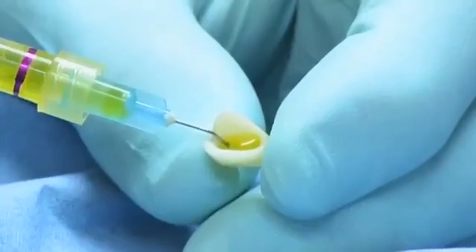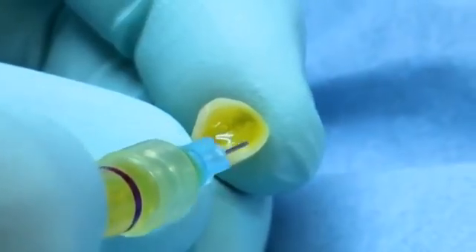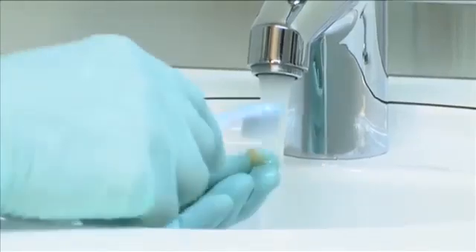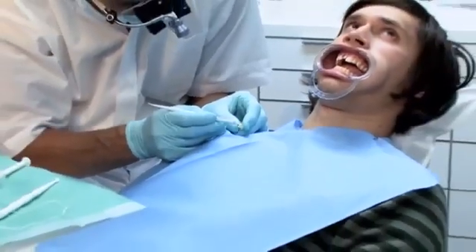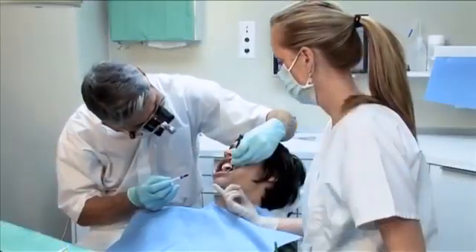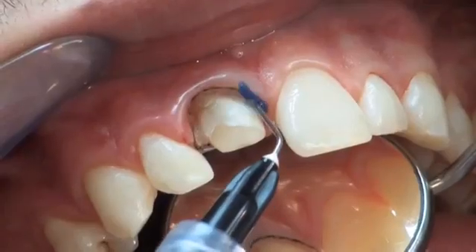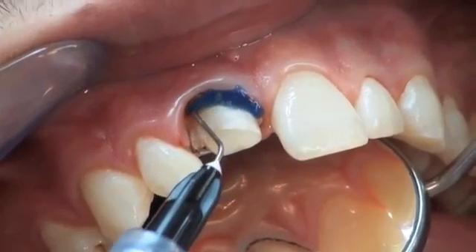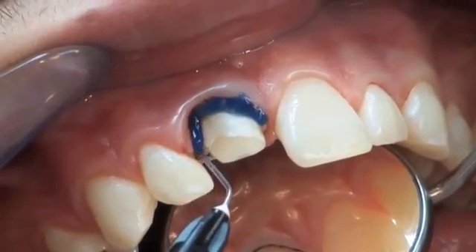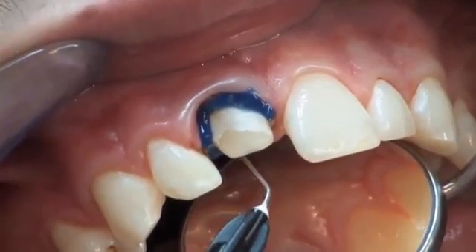Before cementation, the inner surface of the crown is etched with hydrofluoric acid, cleaned under running water and dried afterwards. The etched surfaces are silanized and thoroughly dried. Etching around the margins of the preparation using 35% phosphoric acid is now performed. The etchant gel is rinsed off thoroughly and the tooth is gently dried.